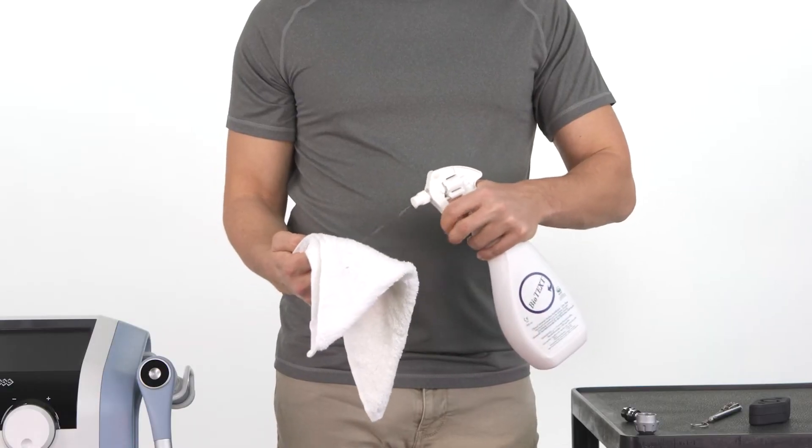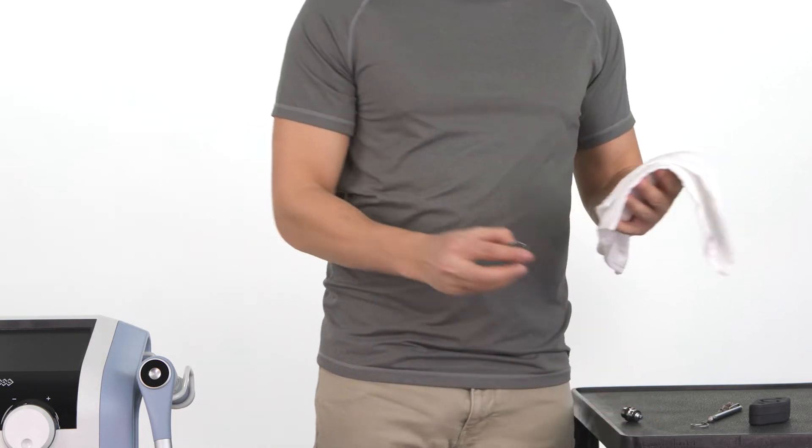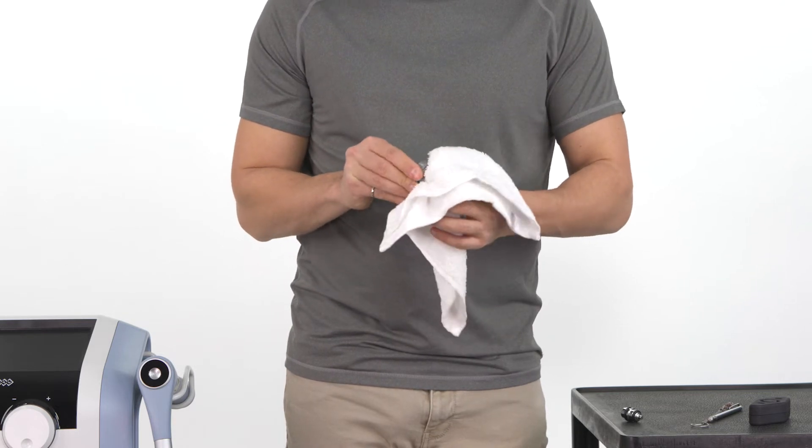Moisten a towel with a non-aggressive disinfectant like Biotext. Use the towel to thoroughly wipe the inside and outside of the transmitter holder.